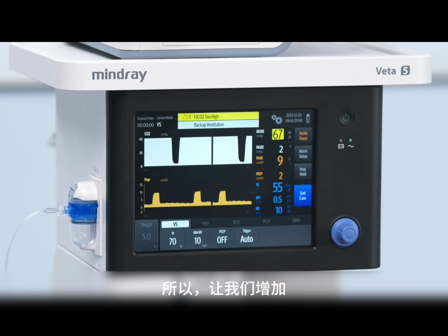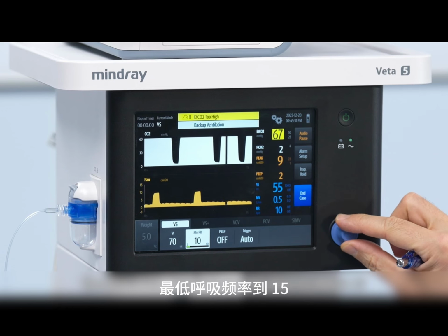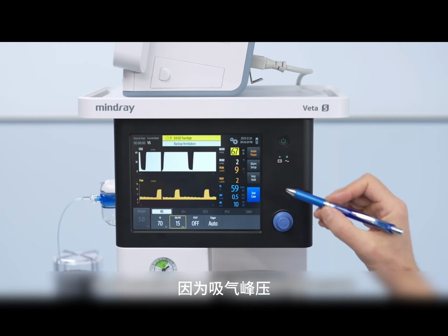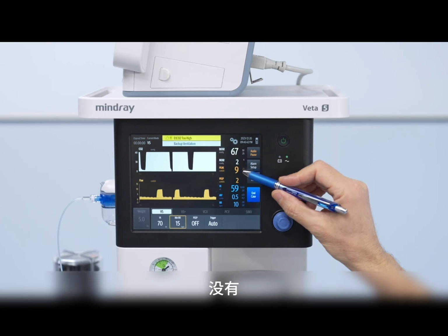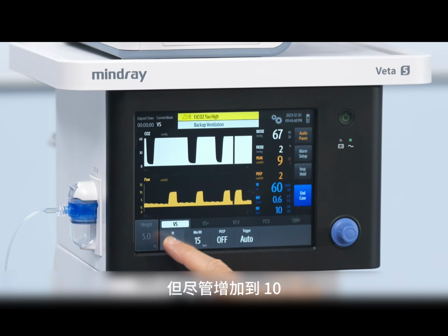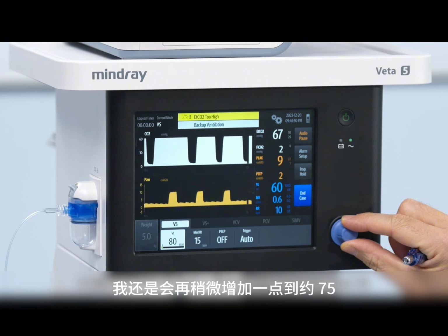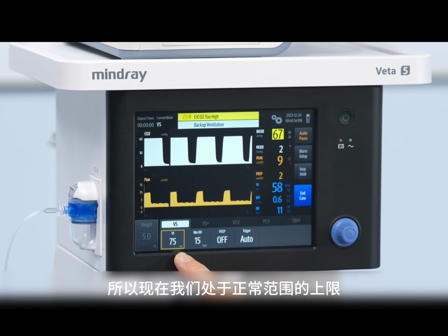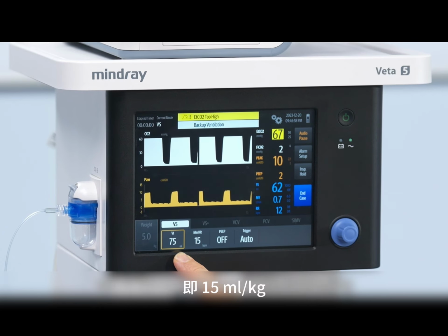So let's increase the minimum respiratory rate also to about 15. And because the peak inspiratory pressure did not increase any further, now it increased to 10, but despite it increased to 10, I will increase it just a little bit more to about 75. So now we are at the upper end of the normal range, which is 15 milliliter per kilo.